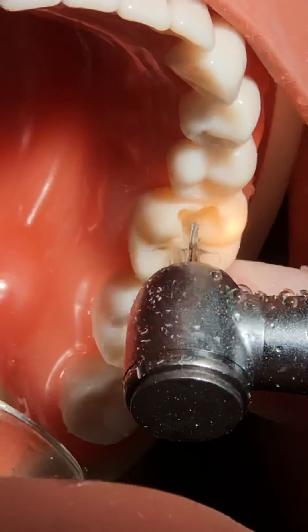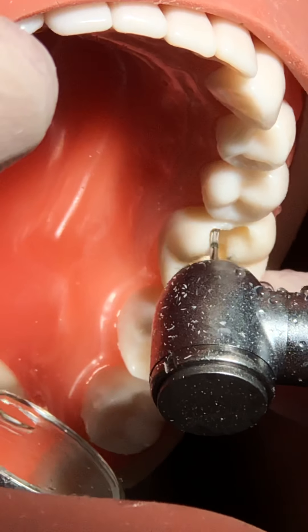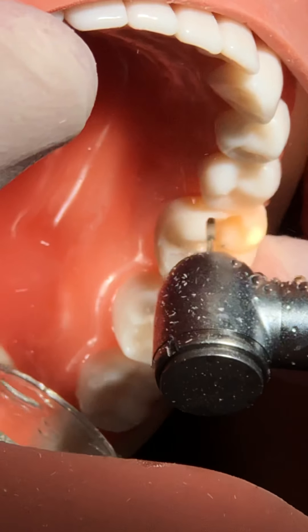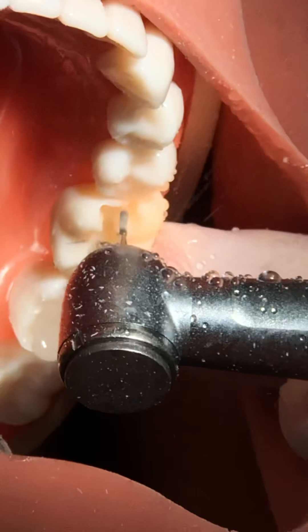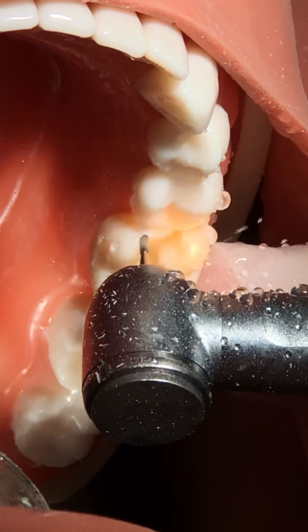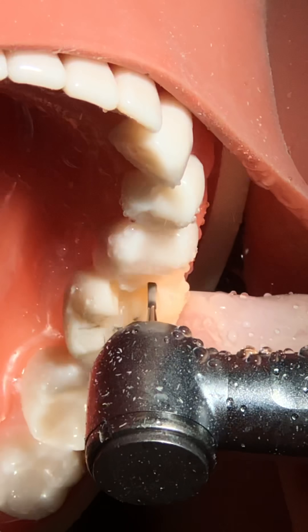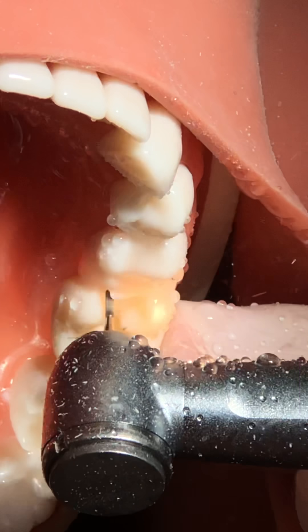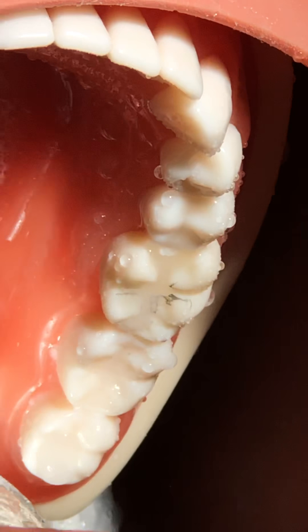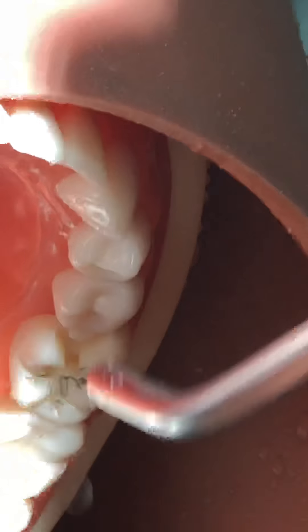We'll go slightly more. Check the depth - if there is something to be corrected you can correct it at that point. The cavity has now been extended into the buccal and lingual embrasures. Please remember that the contact point is still intact.